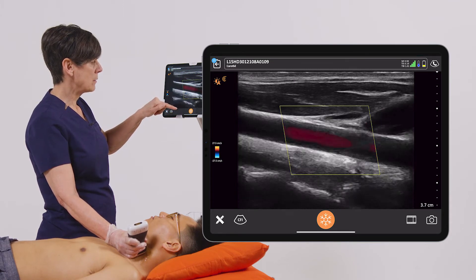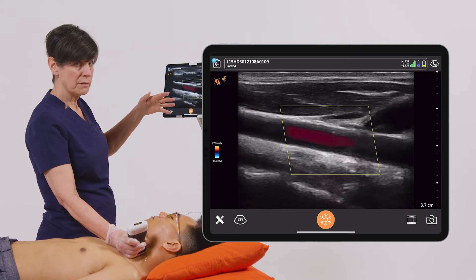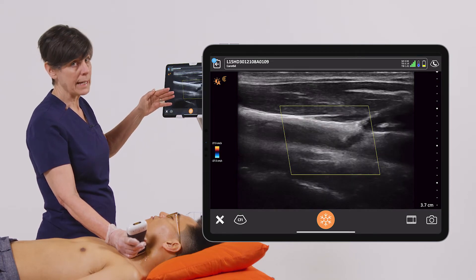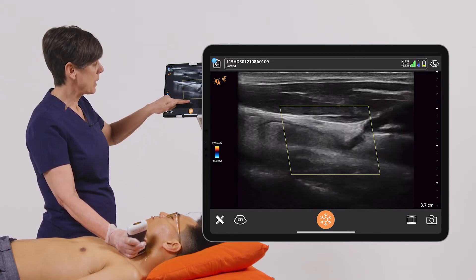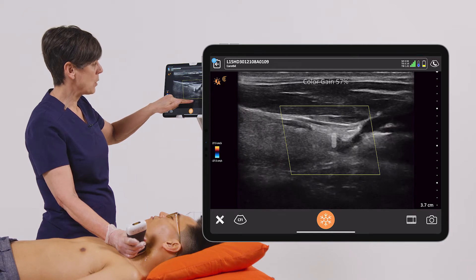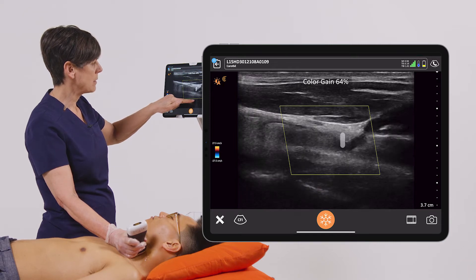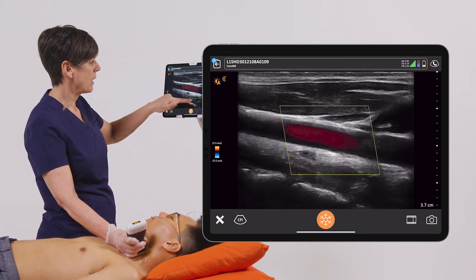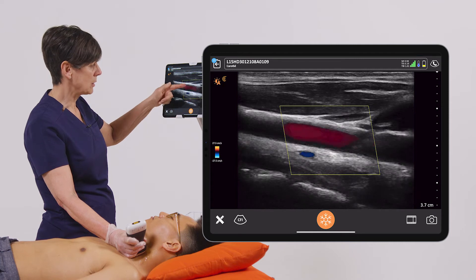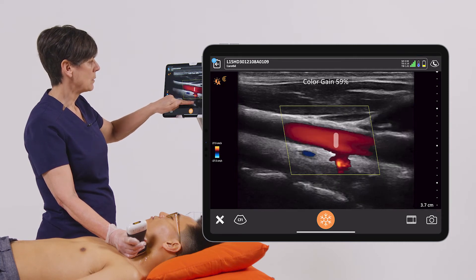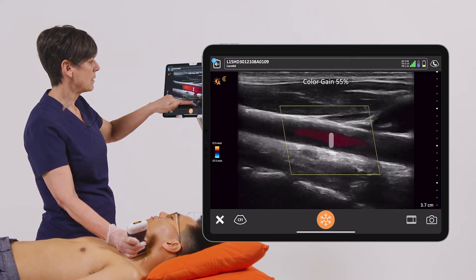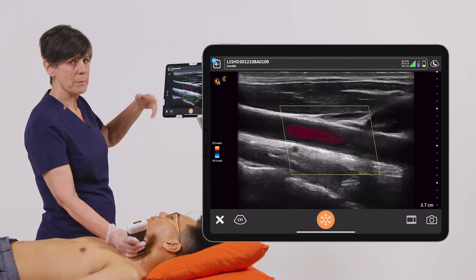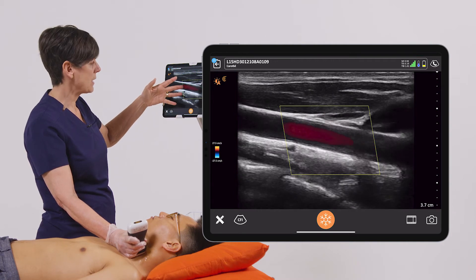Now if I want more color flow or less color flow I can increase or decrease the gain by just holding down my finger and swiping to the right or the left. Now I have too much color so I'm going to go to the left until we have just the right amount of color filling the vessel.